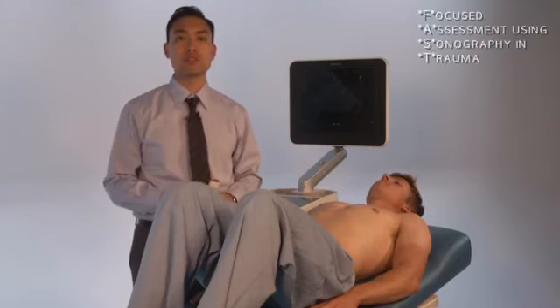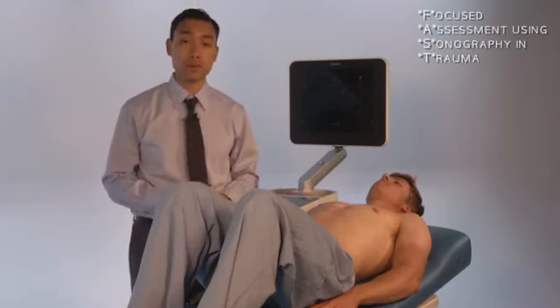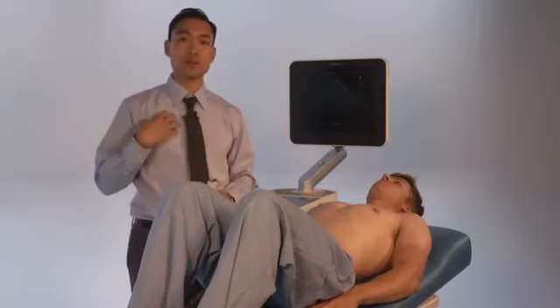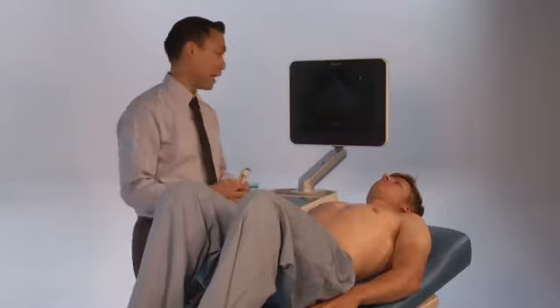So now we're going to go over how to perform the FAST scan. And this is a scan that's used in trauma. It's called a focused assessment using sonography for trauma. You're basically looking for free fluid in the abdomen, around the heart, in the chest, as well as looking for pneumothorax of the chest. So we're just going to go over the protocol that I use.